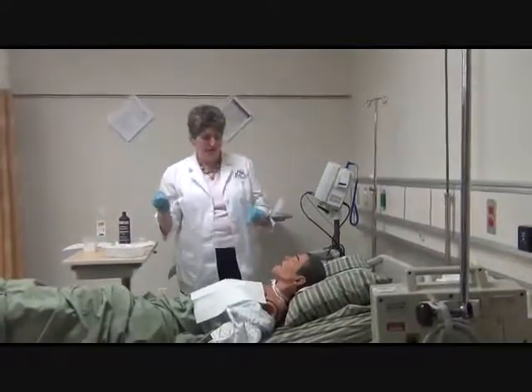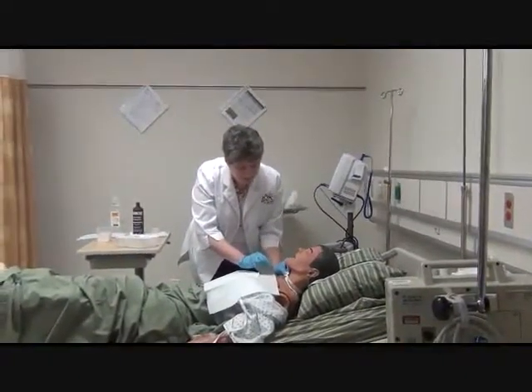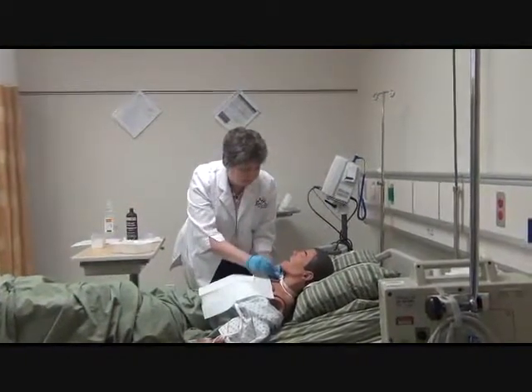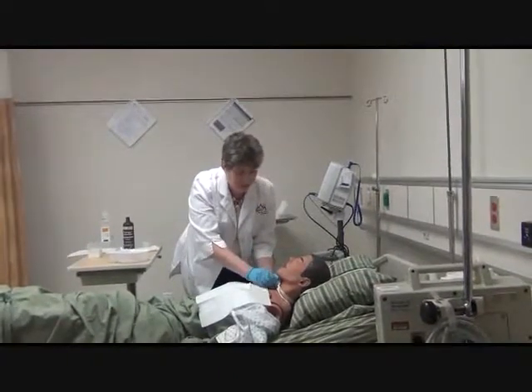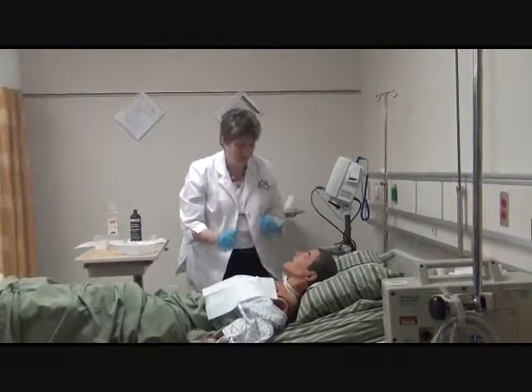water off. And then you're going to come back to your face plate, work from the front, tell the patient what you're doing. I'm putting your catheter in. Doing okay. And then avoid looking directly into it while you do this. You need to make sure that these are snapped securely in place or tightened the way that you're supposed to.